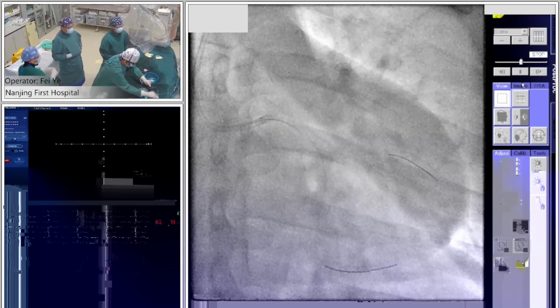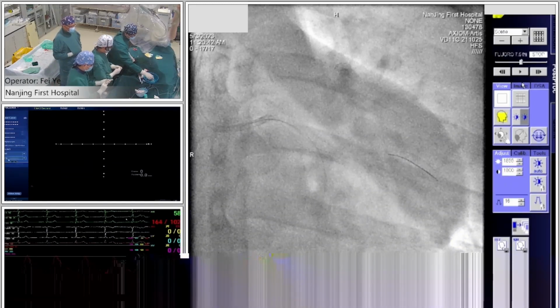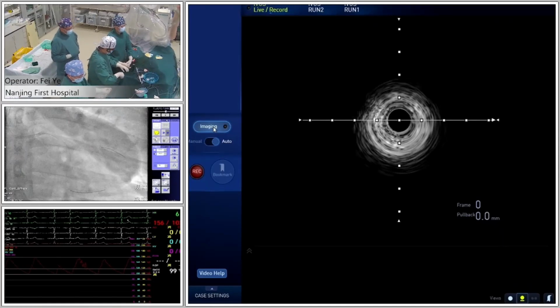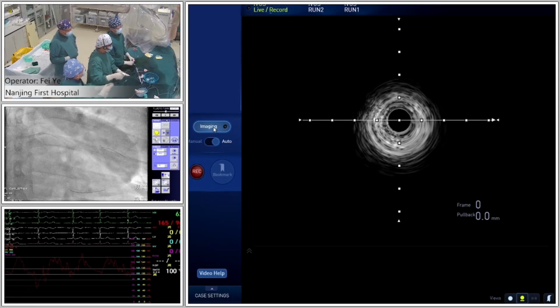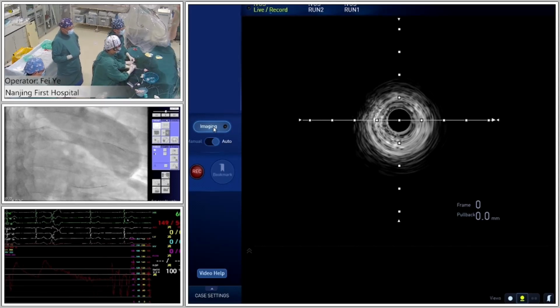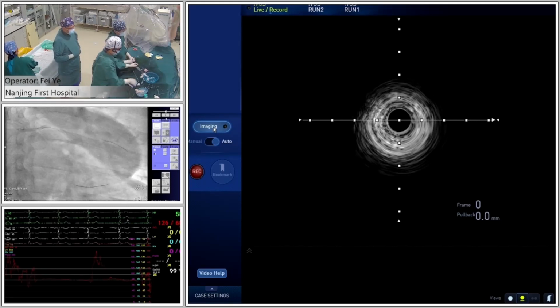Yes. Another question is how to treat this kind of bifurcation lesion based on the angle. Actually, according to the angle, although it is very significant and very difficult to access, it's a very short lesion. Also you can see after you successfully wire the OM, the distal bifurcation angle is straightened and also smaller. So in this scenario, I fully agree. I will gently dilate the ostial side branch with a small balloon, and check the IVUS. Then make a decision.